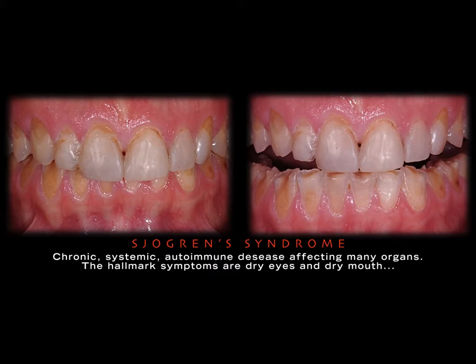This young lady has Sjögren syndrome, and as you know, that is really a very critical situation because you have no saliva. So you can see the wear that the patient has by the erosion, attrition, abrasion. So we really have not so much structure remaining. What to do in this case? Maybe in the past, in a lot of cases like that, we have used some surgical crown lengthening procedure, endodontic treatment, and post and core. That was quite classic, a traditional way to do it.